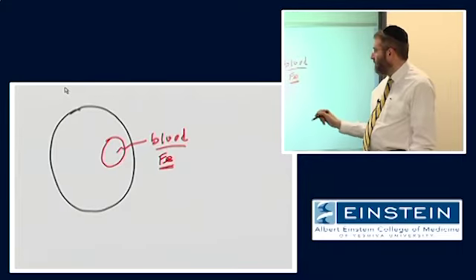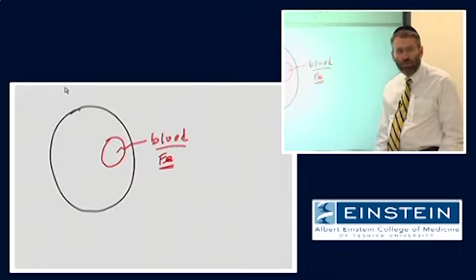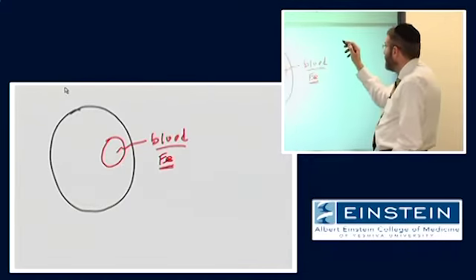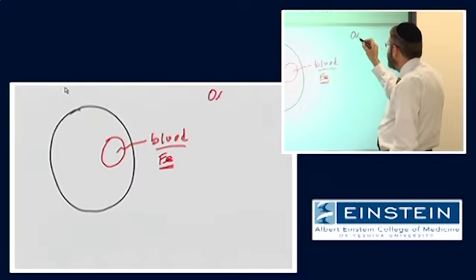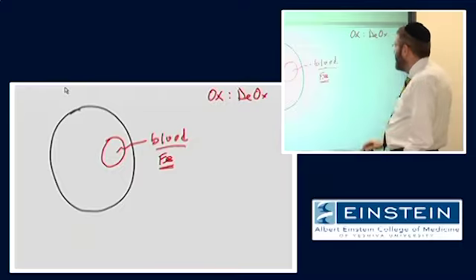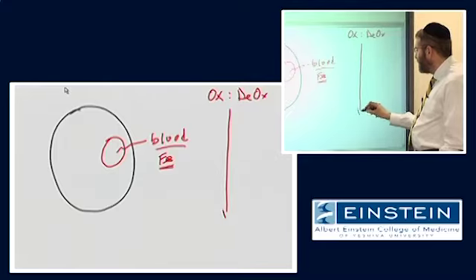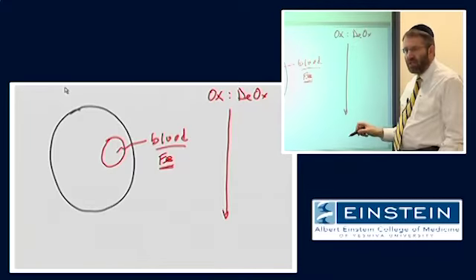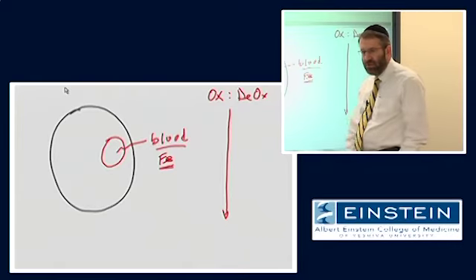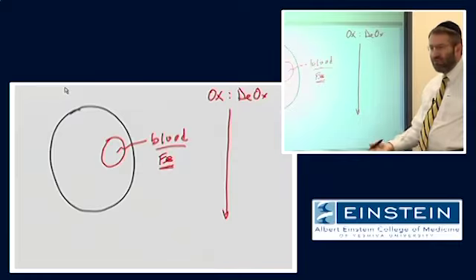So, for example, if we look at what happens when someone has an intracerebral hemorrhage, initially we have some ratio, right, of oxygenated to deoxygenated hemoglobin. And it turns out that, over time, as many of you know, there is a progressive change in the state of hemoglobin as the clot in this hematoma is going to evolve and be degraded and resorbed.